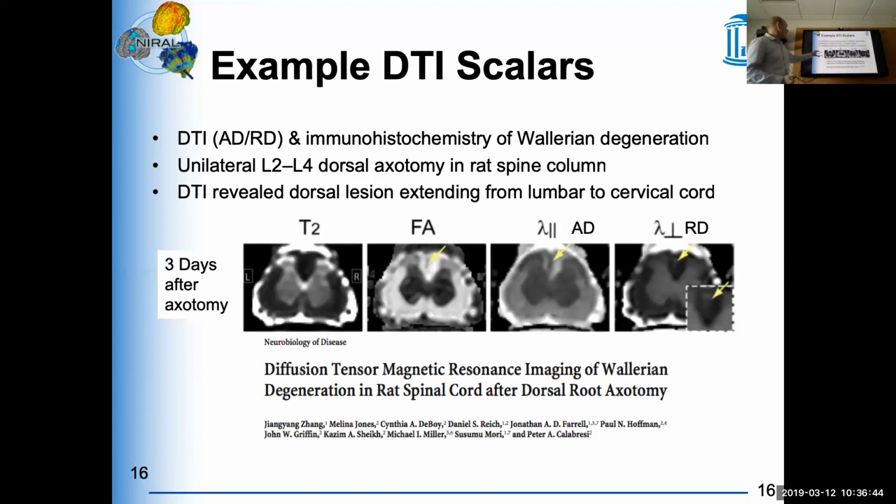In this particular case, it's a rat study where on one side of the spinal column they made an incision and actually cut part of the spine, and didn't cut the other side. So now we have a direct inherent control, where one side should not be affected by anything that happens to this intervention, whereas on the other side, obviously there's going to be a strong effect due to the surgery that was done.